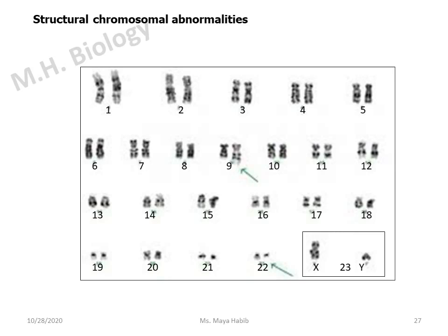Another type of chromosomal abnormality is a structural chromosomal abnormality, in which the structure of a chromosome is affected. Let us take a close look at the homologous chromosome pairs and compare them. You can detect 2 differences among 2 pairs, pair number 9 and pair number 22.